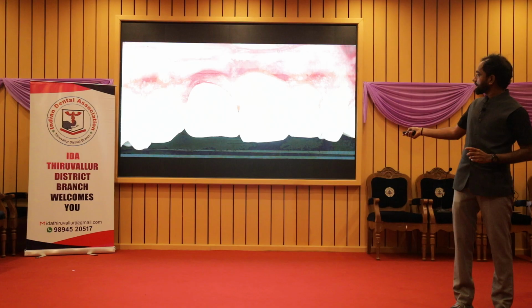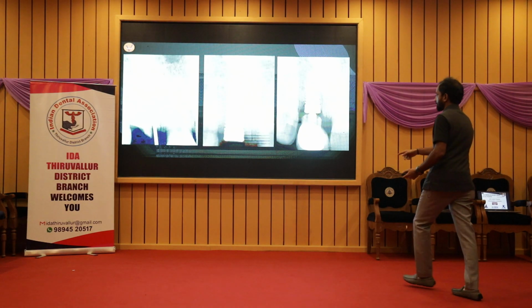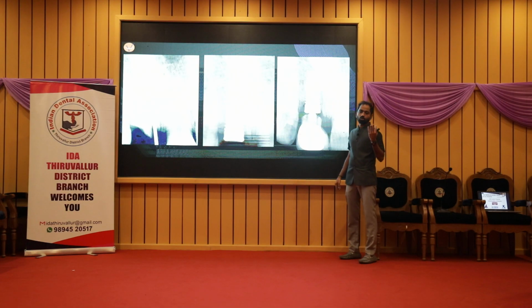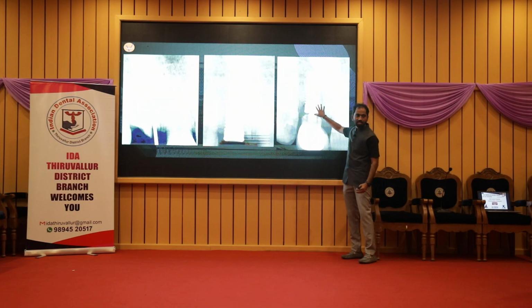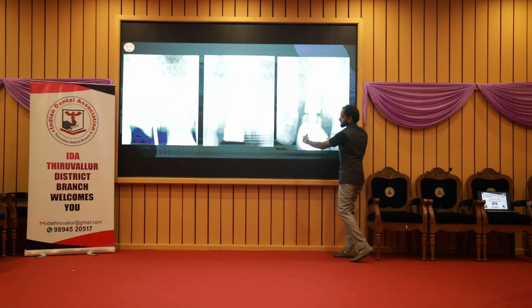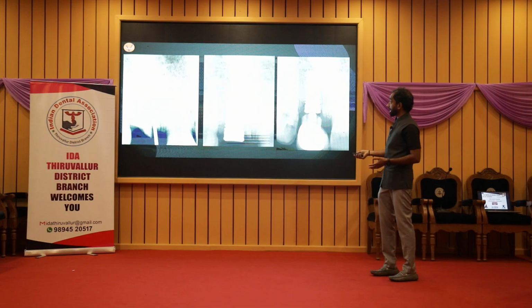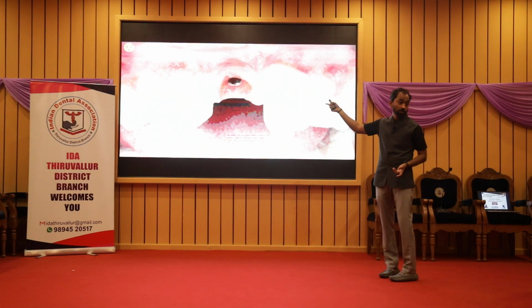So it healed and it came like that. This was the same crown I gave to the patient, because the patient cannot go without a tooth. So this was given immediately after the implant. Because the tooth, the central incisor, is triangular in shape, it created the exact emergence profile which I wanted to get.